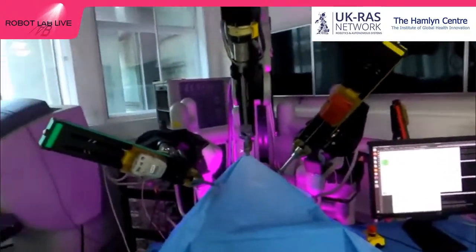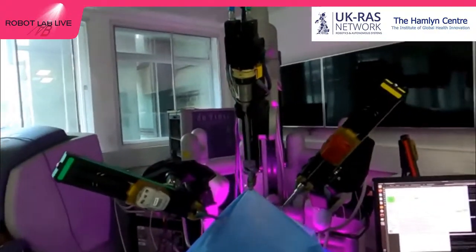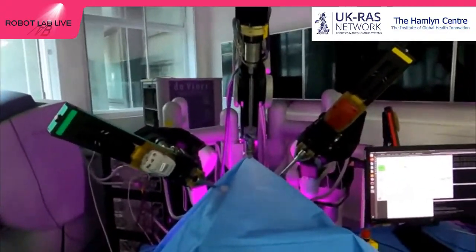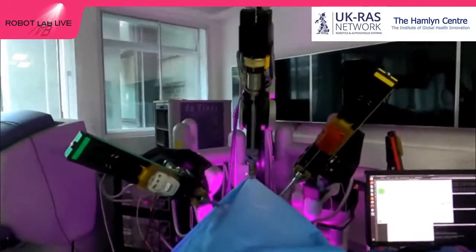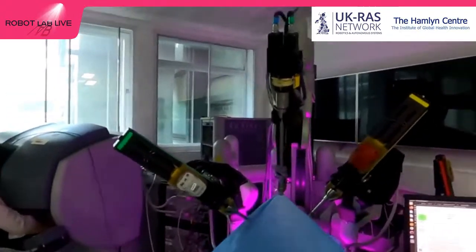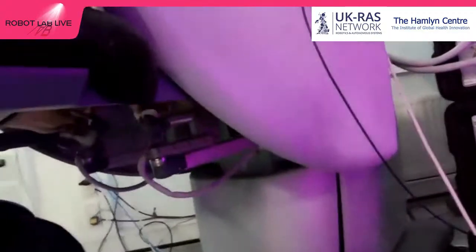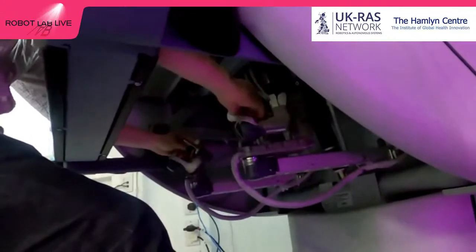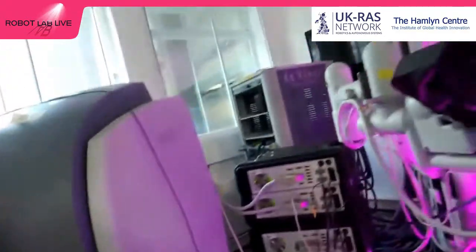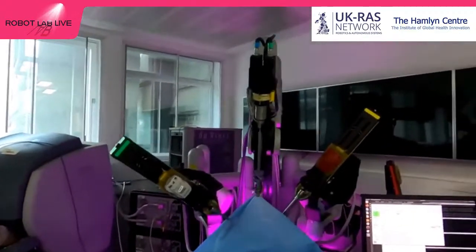But yeah, coming back to the actual robot, as you can see, it has 3 arms. But let's focus for the moment on the green on the left and red on the right. So these 2 arms are as if the surgeon would be inside the patient, right? So it's quite cool to think about that. And if you ask yourself, how do they move? Here we have Sen that is moving these 2 pairs of handles. And every movement that Sen does is translated in real time to these pairs of arms.